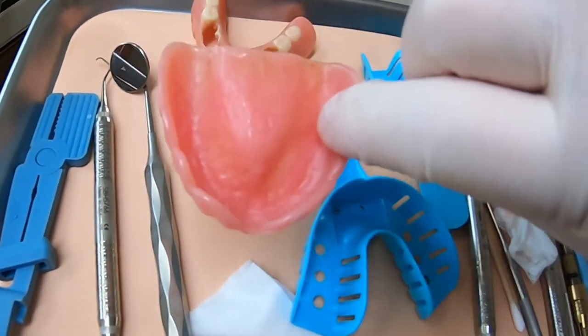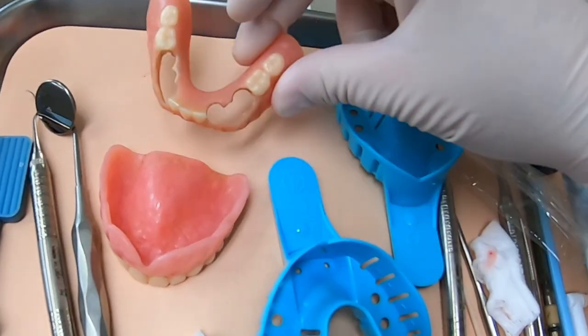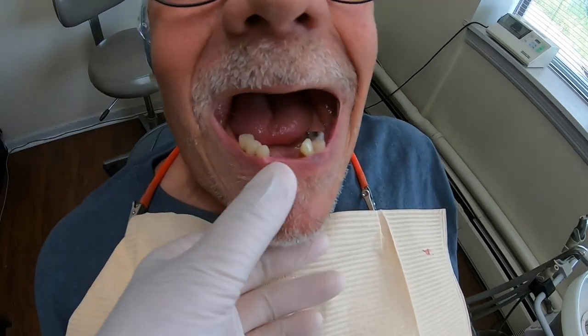Hey, I'm Dr. Rich. Thanks for joining me. A patient of mine needs a new upper denture and a new lower Q-cell partial denture, and he was kind enough to let me film him. Here's a look at his mouth.